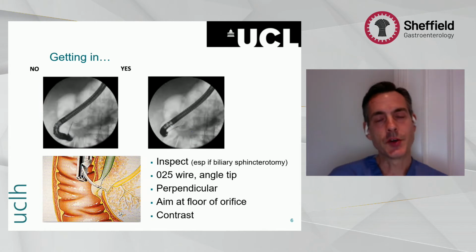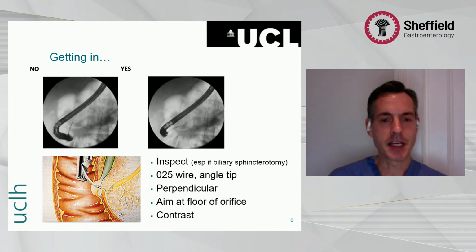So once you've decided to go for pancreatic endotherapy, what are the tips to getting in? Again, our fellows are no strangers to this in their early days, but you want to have a relatively short scope position.